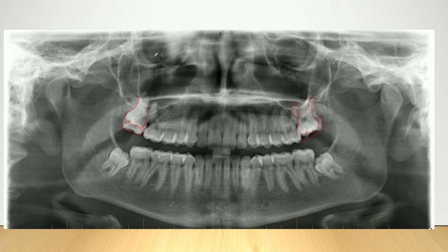So basically, for example, if I draw, the 7 was here, and the 8 was pretty much like this, and then the 6 was here, and the 5 was here, and 4 was here. So I just took out the 7 and left the 8 in there. So good spotting, Paul. That's the story with that OPG. I haven't seen that very commonly. It's pretty much a buccal impaction of the 7, or you can call it a palatal impaction of the 8. Thanks for spotting that.